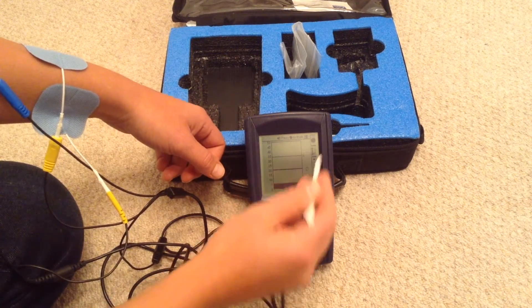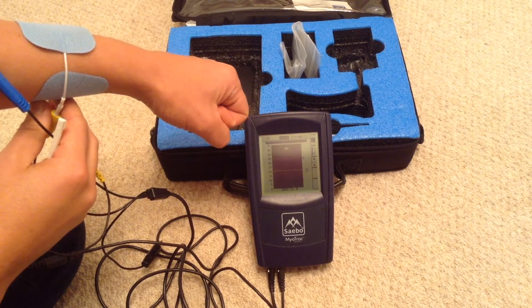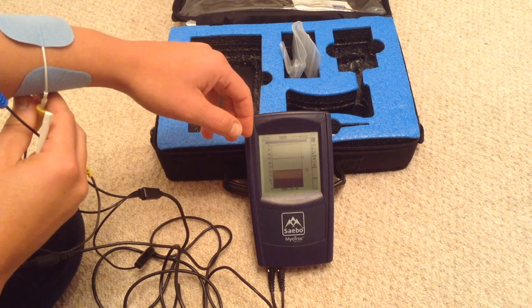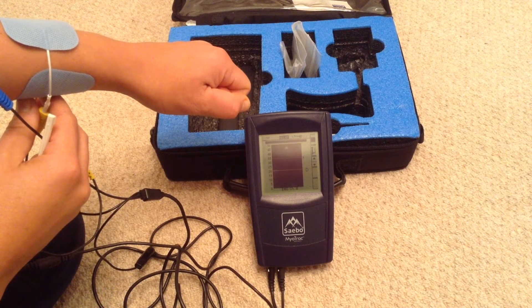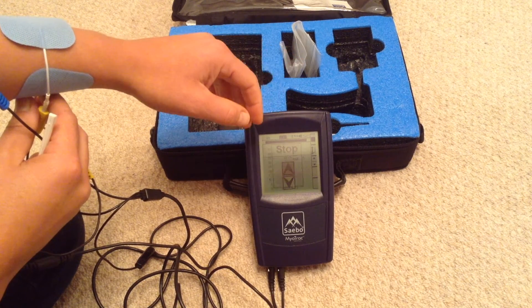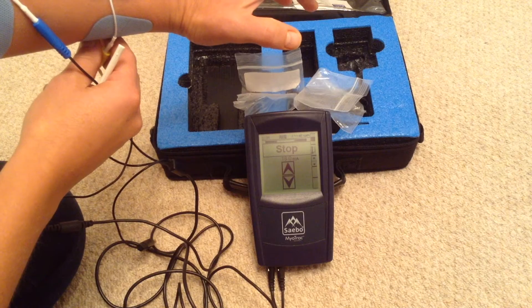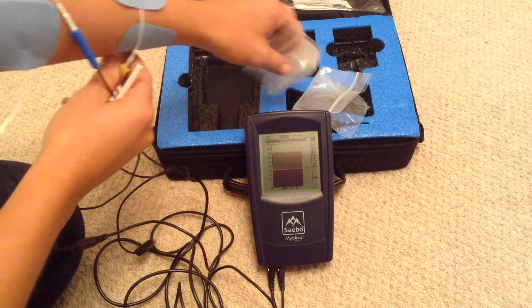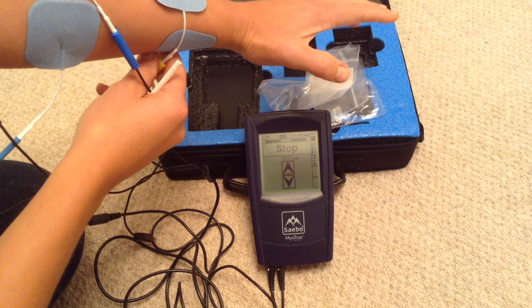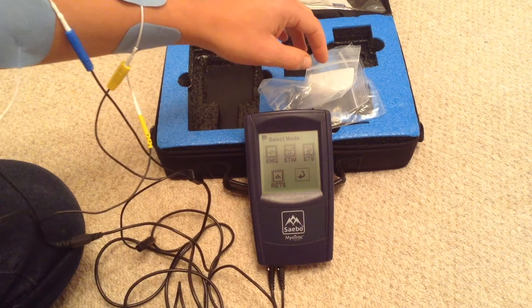So now I'm going to press run. If I work, then as soon as I relax beneath the D, the stimulation comes in to open my hand. So I work to pick it up, and only when I relax and drop beneath the D does the stimulation come in. So if I were to take this into a task — you pick up this bag of cable, then drop them out. So again, I pick them up, but not until I'm ready to drop them, then place them down with the stimulation coming in.